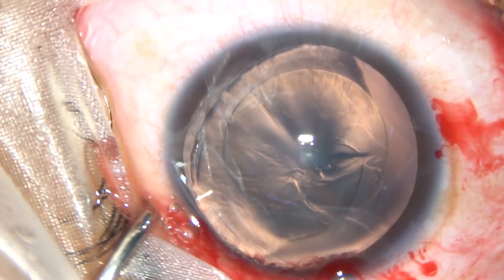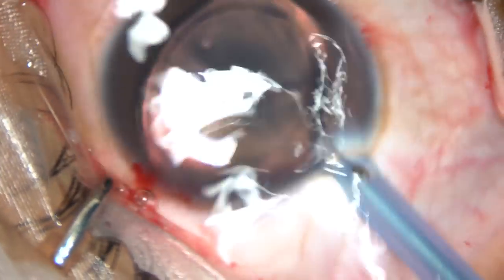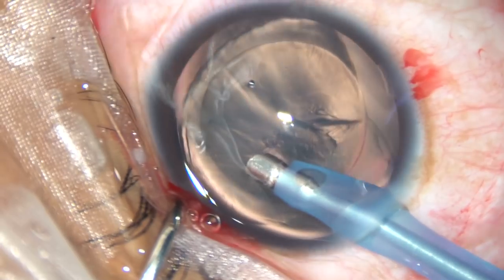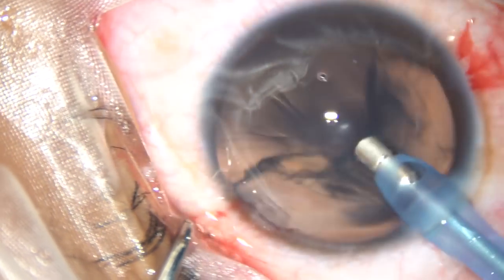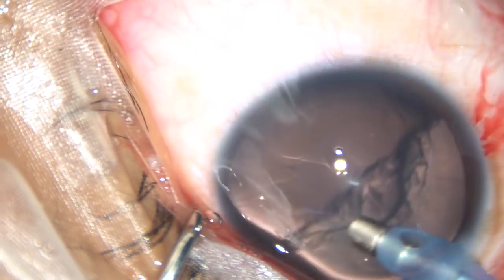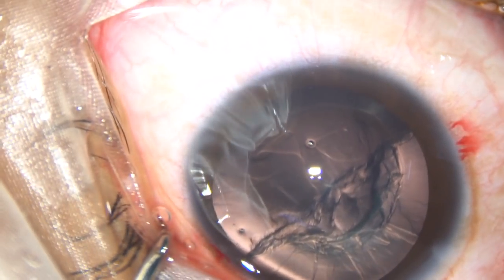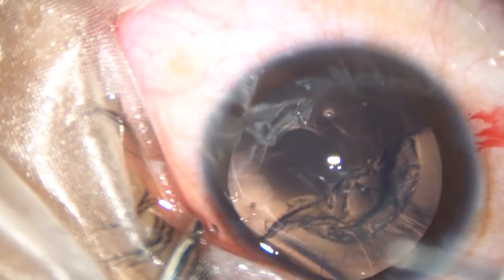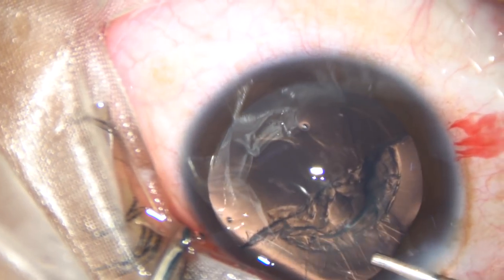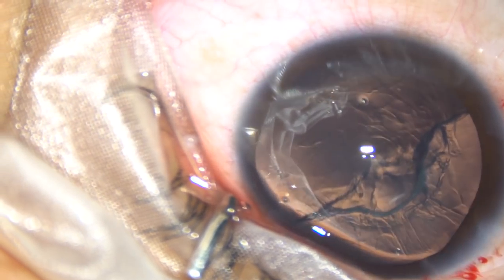The FACO handpiece is introduced. Bevel is towards the nuclear mass, towards the lens mass. And being over the lens mass, just apply vacuum. No energy is required, and most of the lens mass comes out.